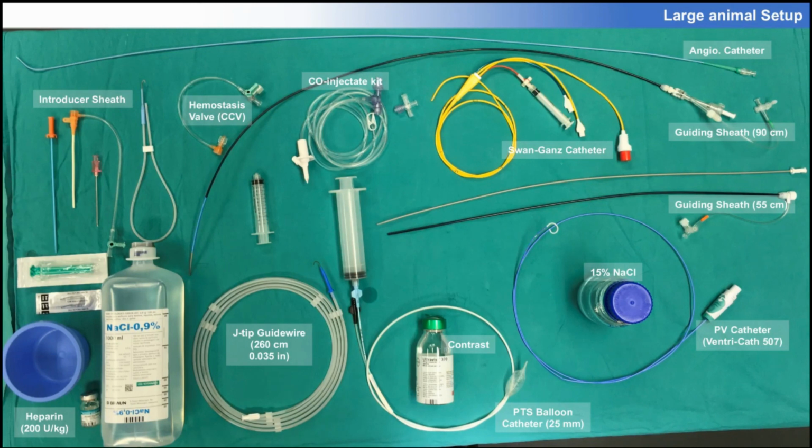Third, we have our guiding sheaths, and these can be a long sheath to reach the LV through the femoral artery, or a shorter sheath to reach the LV through the carotid artery. Through these sheaths, we introduce our Ventricath, which in our case is the 507, and that has a pigtail tip, which makes it atraumatic and avoids damage to the left ventricular apex.